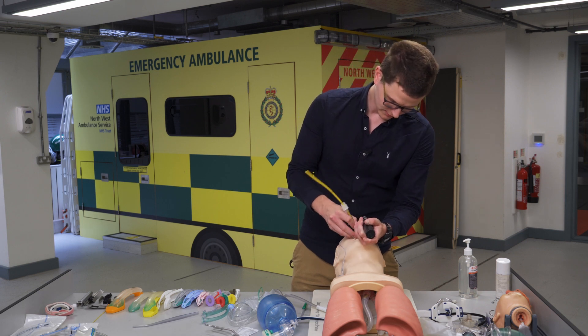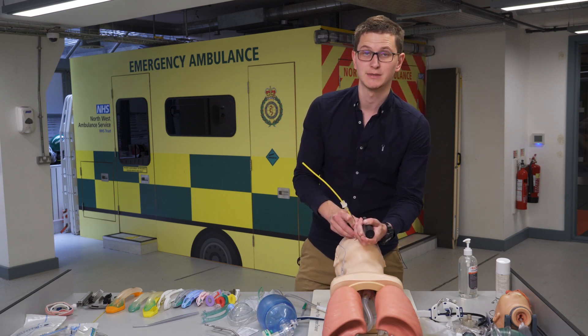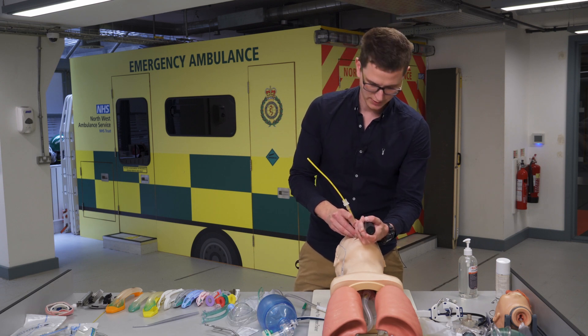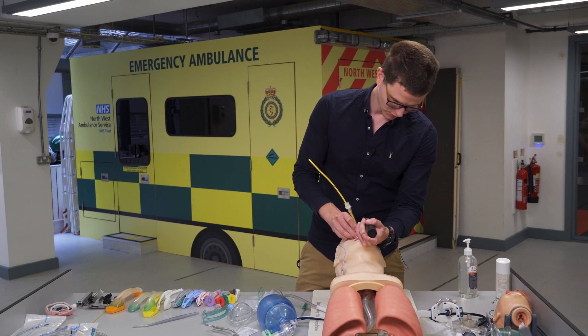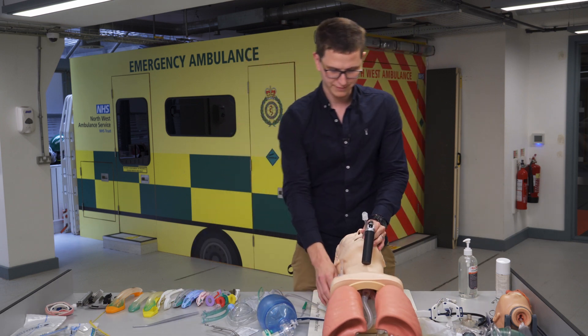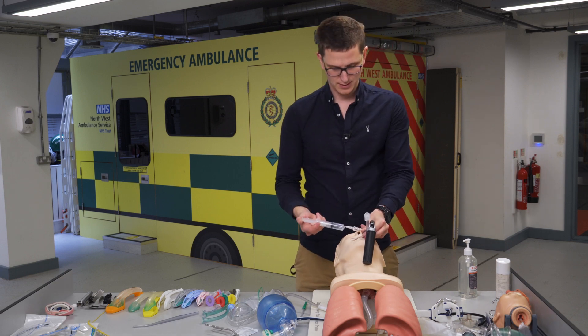Once the bougie is in the trachea, the tube will follow into the trachea. For a size 7 or 7.5 tube, go to three times the internal diameter — so 7, 14, 21 — between 21 and 23 centimetres is appropriate depth. Then remove the bougie, hold the tube, and inflate the cuff.